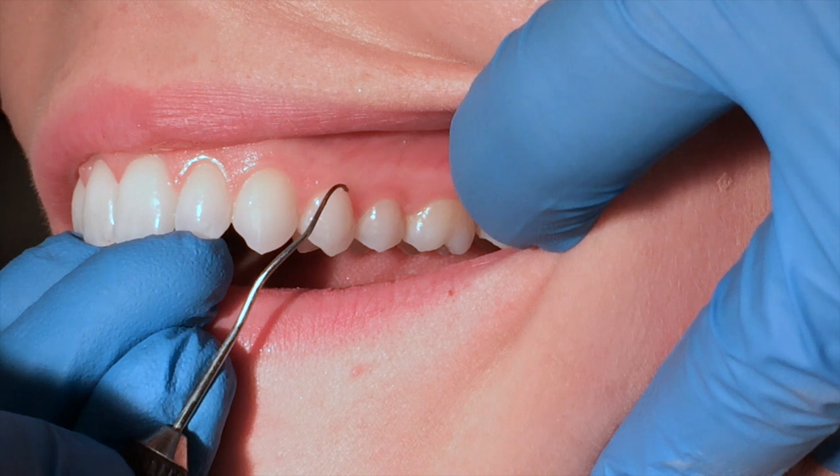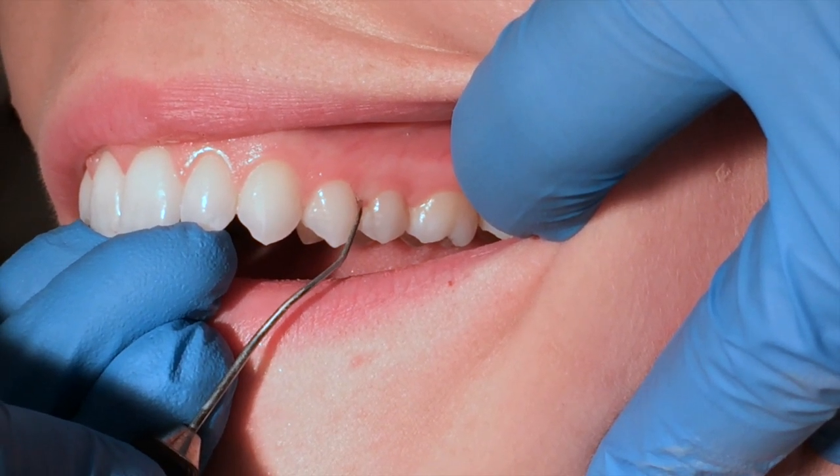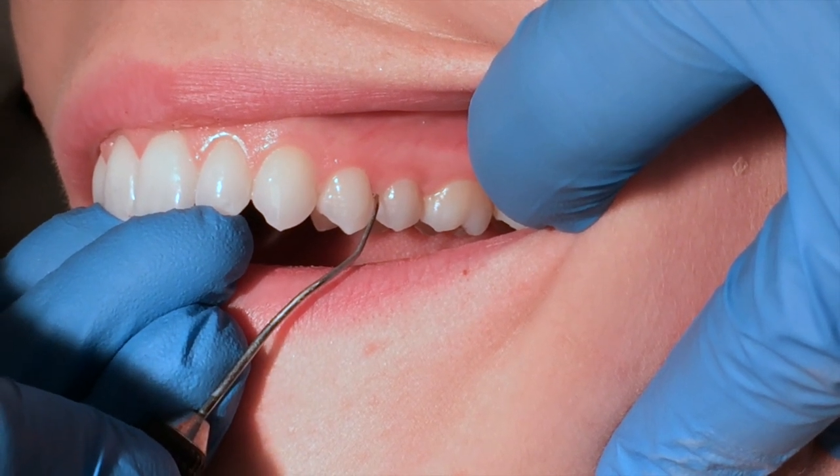I'm going to pull out, start again at the get ready zone. Watch my fingers roll and adapt — adapt, adapt under the contact — and I hit the contact. I'm done.